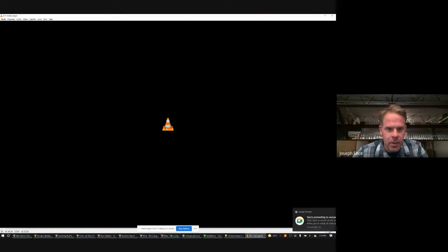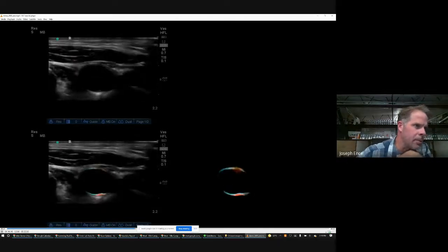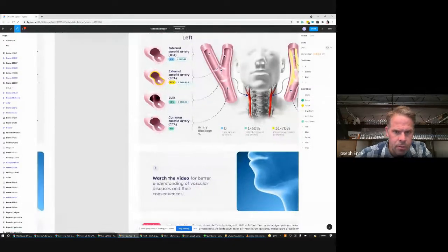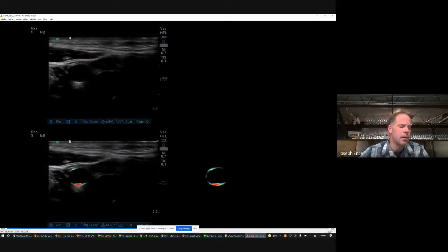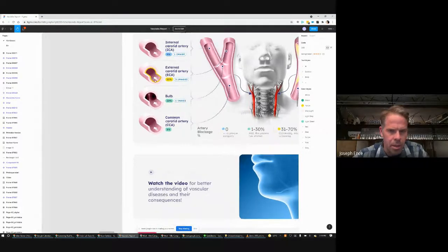Pictures. Okay, so check this video out. This is a sweep up and down an artery. All four quadrants are the same thing. The bottom right is what the AI is measuring. So on that frame in the bottom right, on your report, I may be able to give you a pop out and give this black and white, like a silhouette, so the patient could understand that this silhouette is that. When I hover over it with a mouse, it'll pop up. I'm trying to think of every clever way to communicate to the patient, this is where you stand. And this yellow will be an individual plaque.